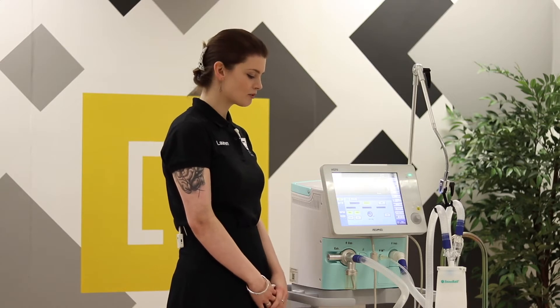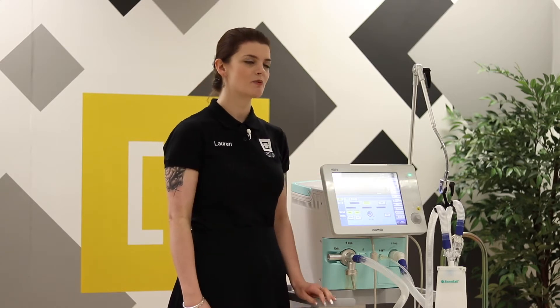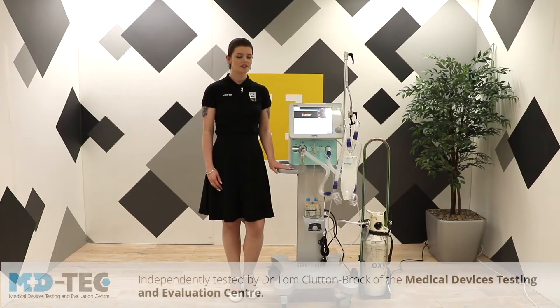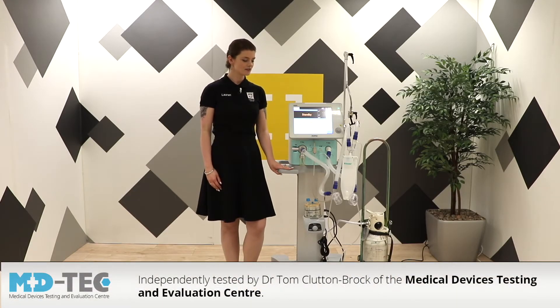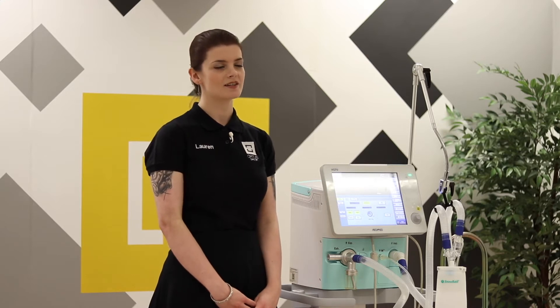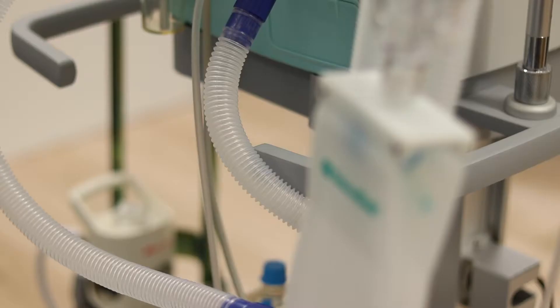These devices were bought in by the Department of Health to prepare the UK for the COVID-19 crisis. They've been independently tested by the medical devices testing and evaluation centre, who agree they are suitable for the UK market. They trigger well, the modes work as expected, and they ventilate stiff lungs effectively.